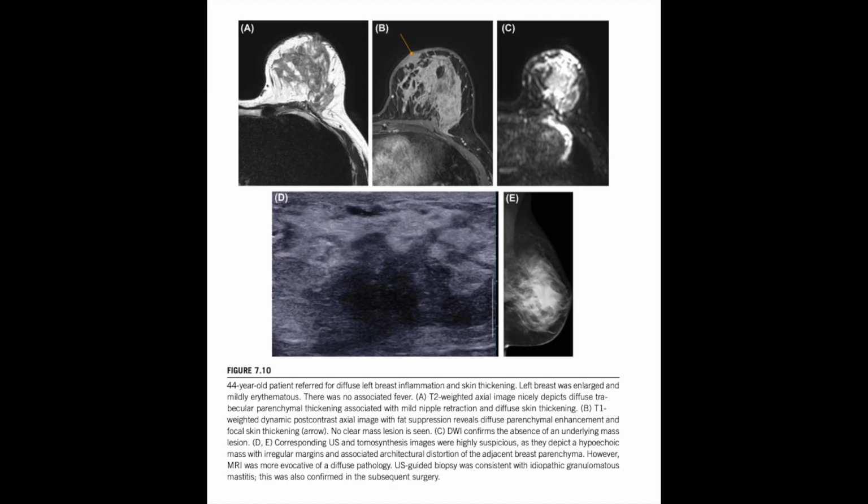What about infections? Like an abscess, do they mimic cancer too? So infectious things like mastitis or an abscess, they're usually diagnosed clinically: fever, pain, redness. Right, the patient feels sick. But on imaging alone, an abscess usually looks like a well-circumscribed, multiloculated lesion, but with this irregular enhancement all around the wall and in the internal septa. And you see inflammation in the tissue around it. Okay. DWI is actually really good at spotting an abscess because the thick pus severely restricts water movement, so it gives a very specific signal.